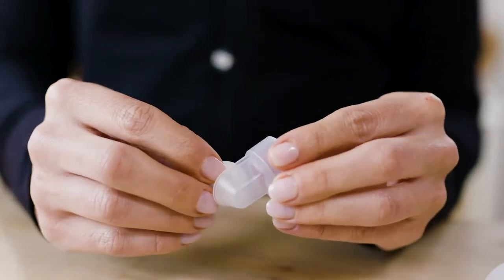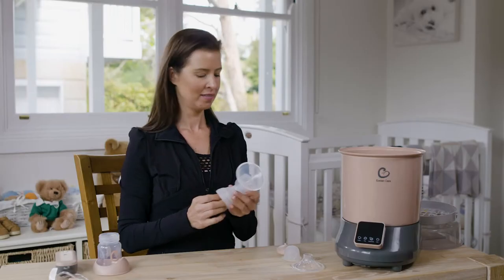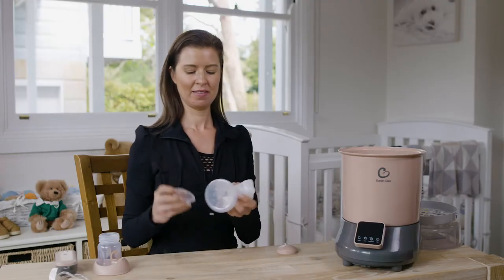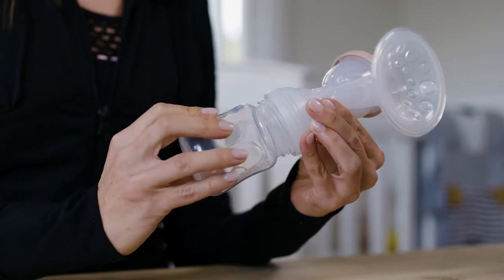Place the membrane onto the valve before attaching it to the base of the connector. Attach the massage cushion onto the breast shield and place the cylinder into the bottom cover. Attach the connector cap and screw on the feeding bottle.